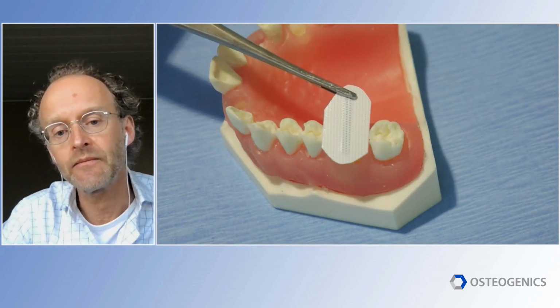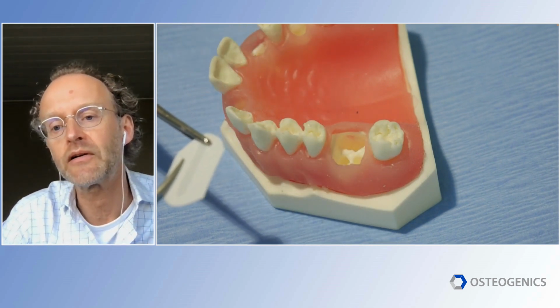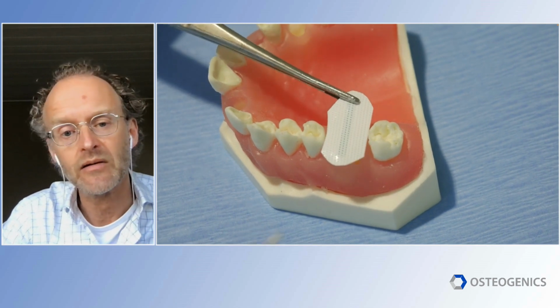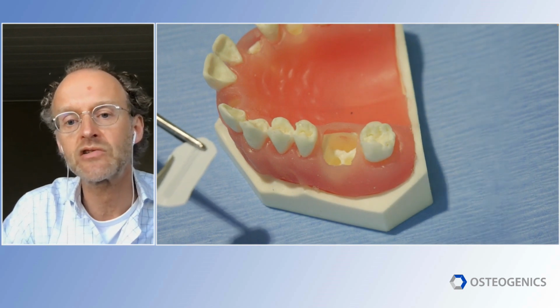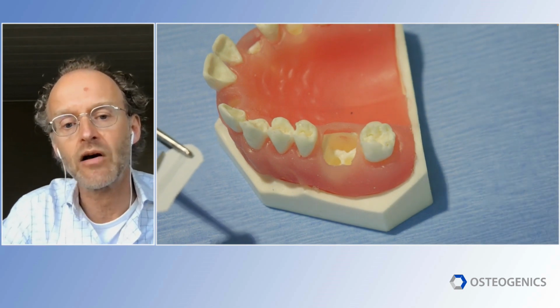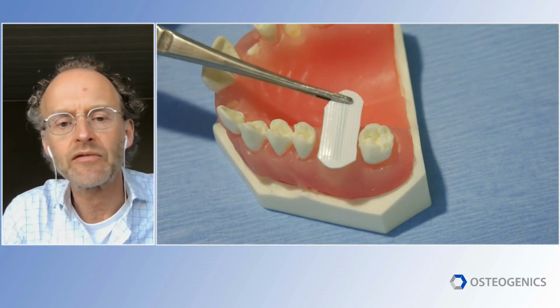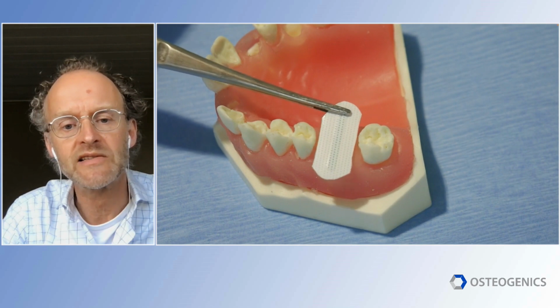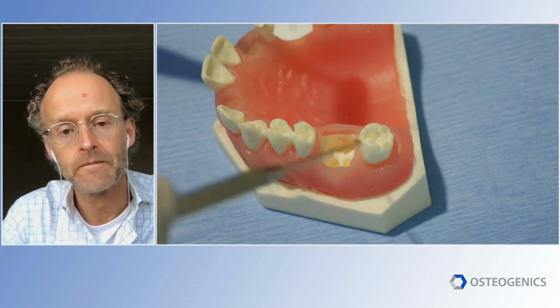Then we check again. And it's too tight, so we cut away a very little from the edge of the membrane. Take it easy and take your time for it. This is still too tight because you should be able to place it underneath the papilla. So that's a real detail you have to take care of. Here, this is better. You can move it a little bit and still it can be covered with both papilla.